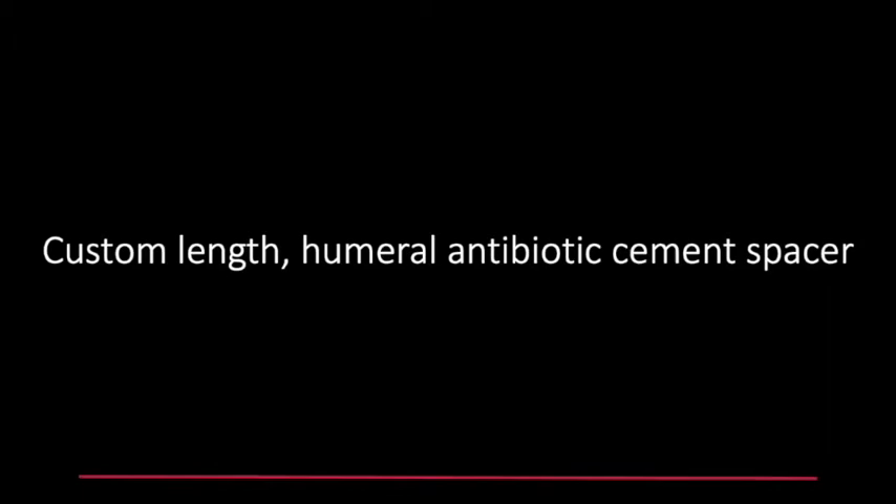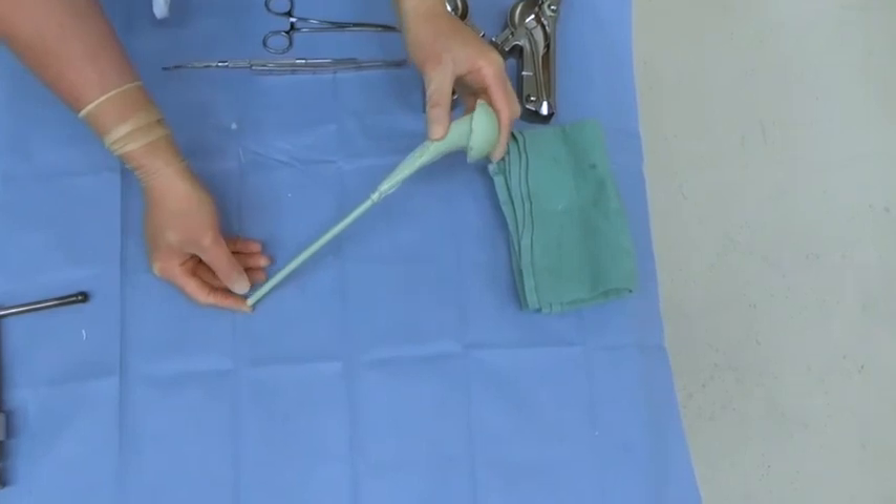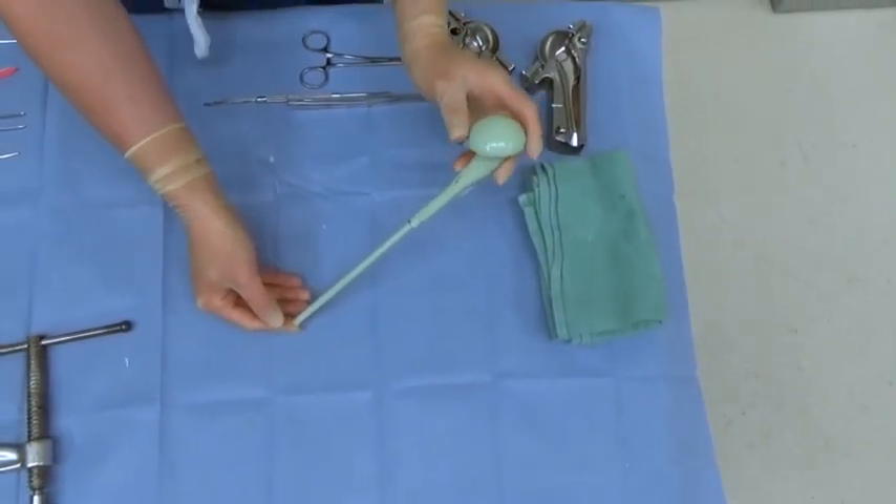You have now created a custom length humeral antibiotic cement spacer. You can trim length with bolt cutters and file with a Darrow retractor for finishing touches.